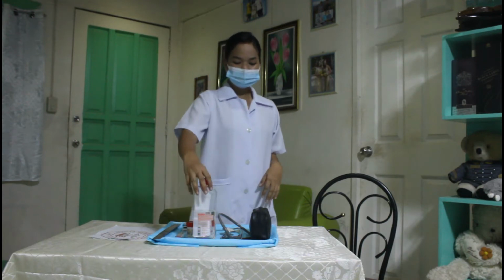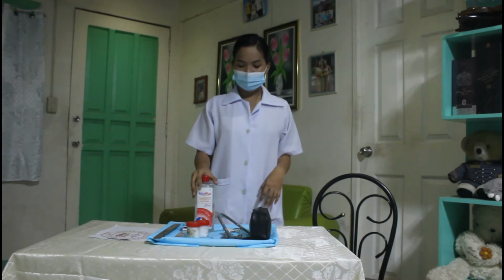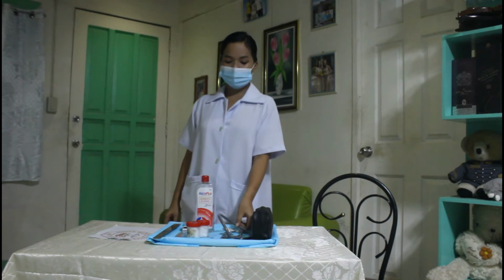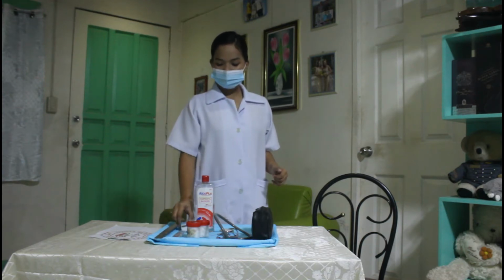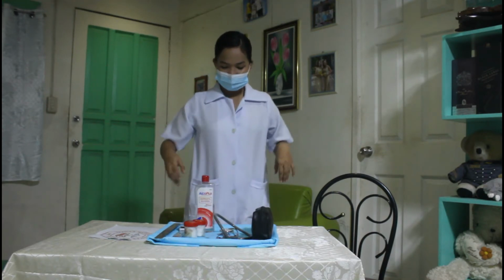So these are the materials needed for taking vital signs. I have here an alcohol for hand hygiene. I have a sphygmomanometer, my stethoscope, a digital thermometer, a ruler, a pulse oximeter. I have here a cotton soaked in alcohol. Then also I have here my pocket notebook.